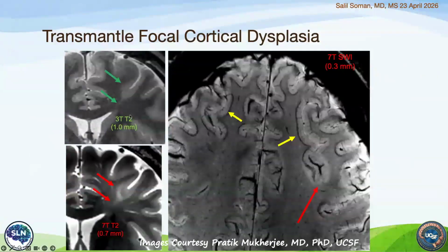There's a focal cortical dysplasia on the T2. You can see that line coming down here on this other T2 weighted image. Again, you can see all this abnormality there. And while you can see that normal band in normal areas, this is the area that we're looking at, and you see the band is gone, right? While I certainly would like to believe that I would see these two things, I'm much more confident that I would see these areas of missing bands. So again, I think it's an exciting application.